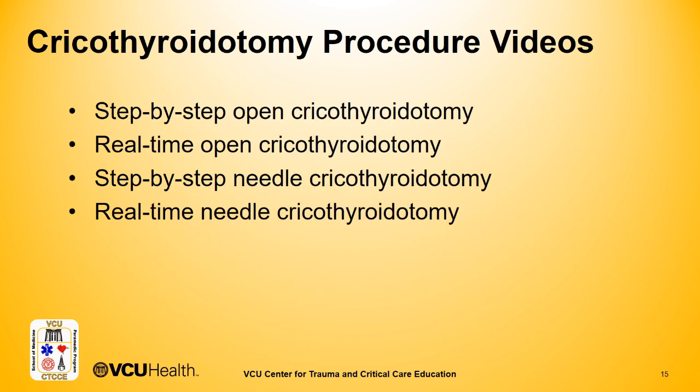At this point, there will be multiple video presentations for surgical airway access. The first video is a step-by-step open cricothyroidotomy. The second video is a real-time open cricothyroidotomy. The third video is a step-by-step needle cricothyroidotomy, and the fourth video is a real-time needle cricothyroidotomy.